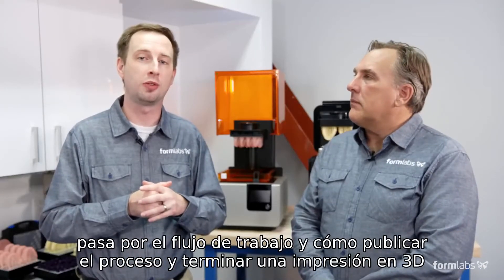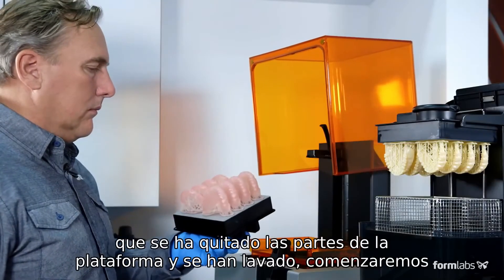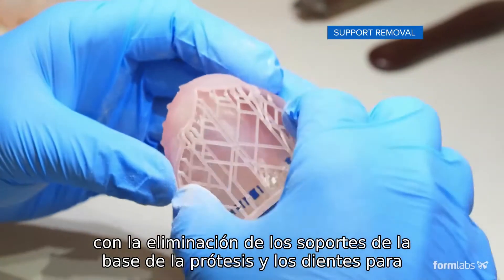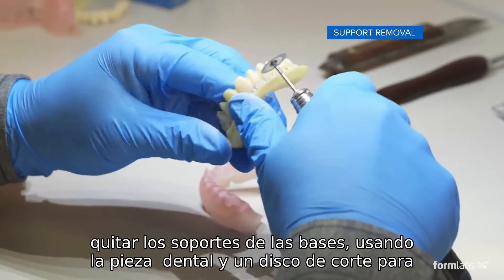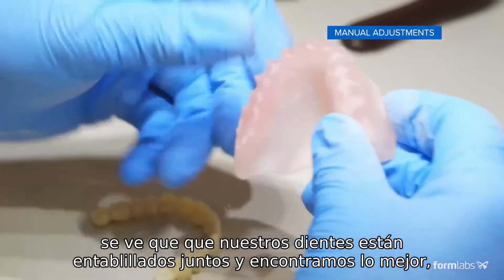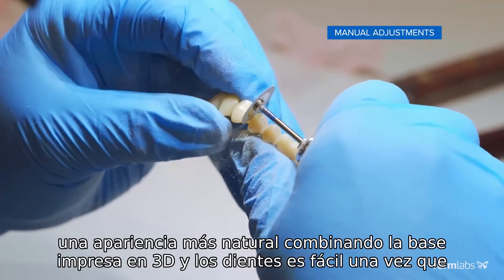In this section, we're going to go through the workflow and how to post-process and finish a 3D printed denture from the Form 2. We will be picking up right after the parts have been removed from the build plate and washed. We will be starting with removing the supports from the denture base and the denture teeth. To remove the supports, Bill is using his dental handpiece and a cutting disc to cut the supports and smooth them away. After the supports are removed, you'll notice that our teeth are splinted together, and we've found that for the best aesthetic results, reduction of the interproximal connection will help make a more natural look.